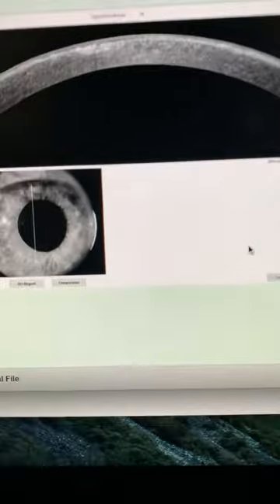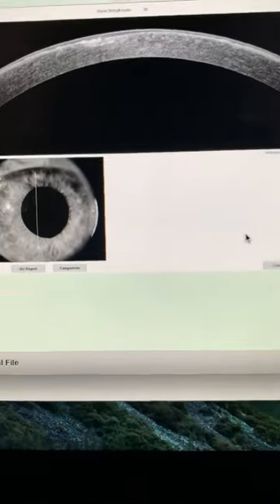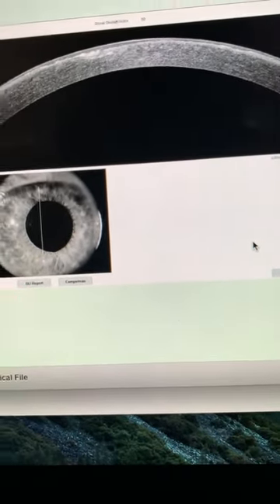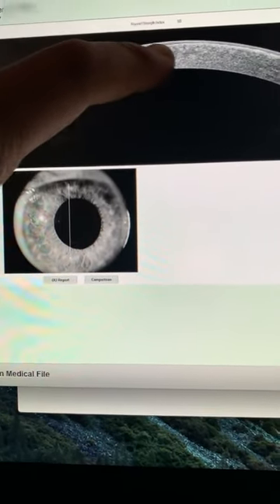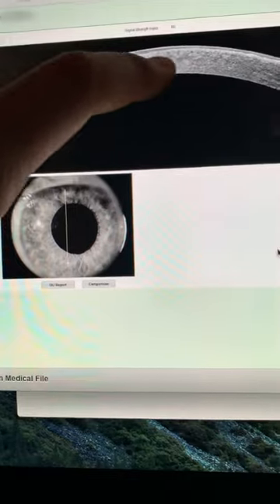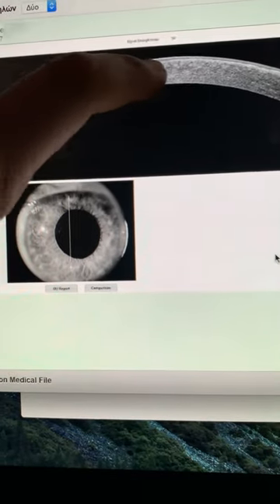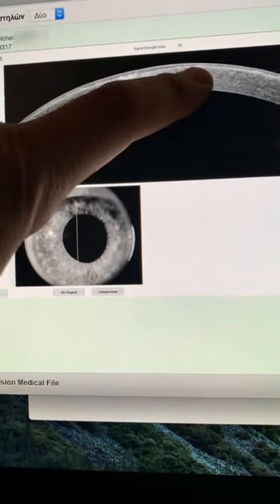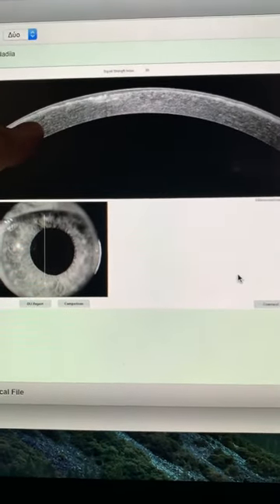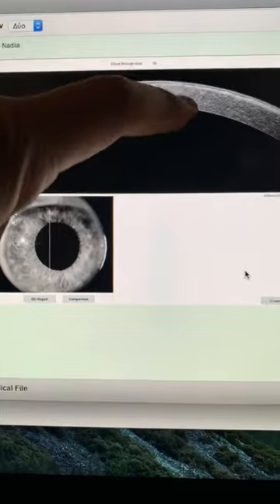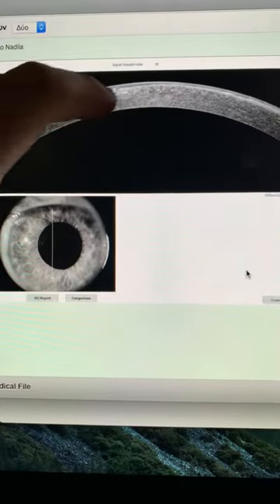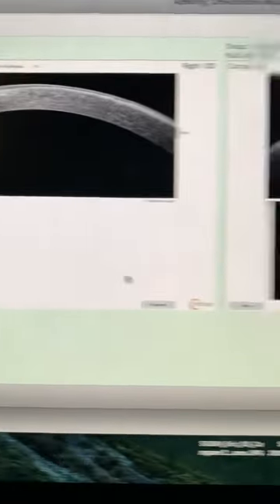We're going to see images now of her daughter — the patient we are evaluating is her daughter. Her daughter had undergone a PTK procedure in Ukraine, and we can see in cross-section of her cornea with the anterior segment OCT that the central cornea is clearer than the peripheral cornea.